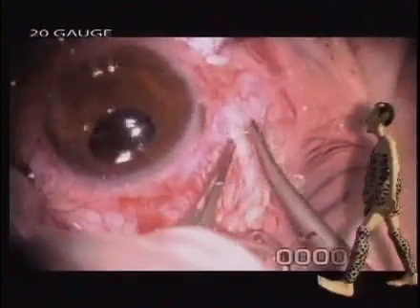Cases were complicated. They needed special instruments for special tasks. The surgery requires skills — complicated, complex surgery.